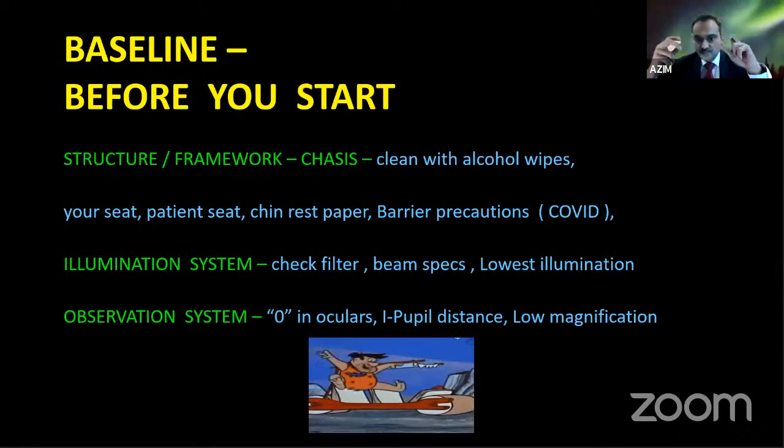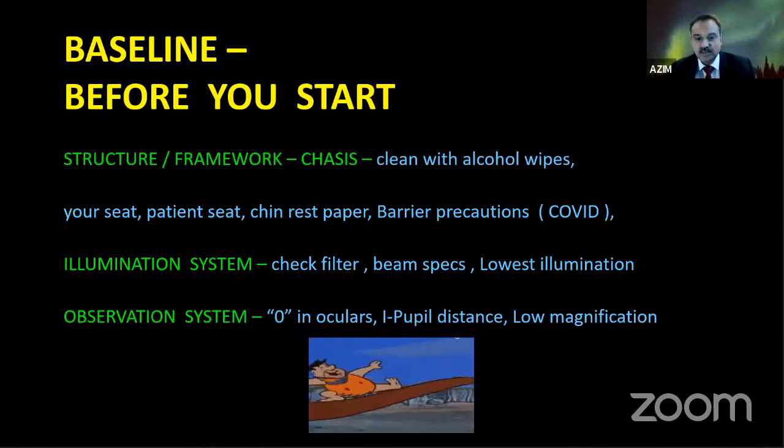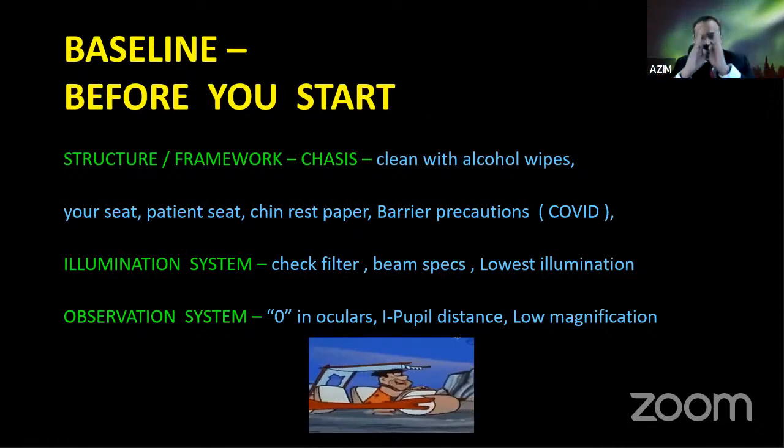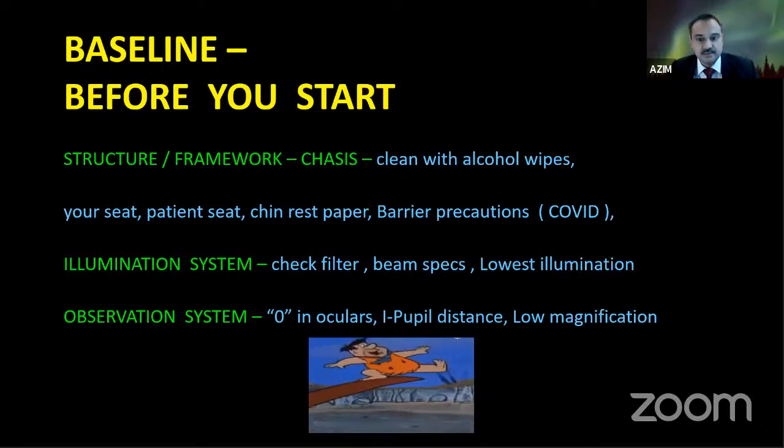Beam specs to keep it minimum, and start with the lowest illumination. So like starting a car, keep it in the lowest illumination before you begin. Observation, get into 0, 0, adjust the interpupillary distance, and keep it at low magnification before you start. Once you do this, you're ready to get started.